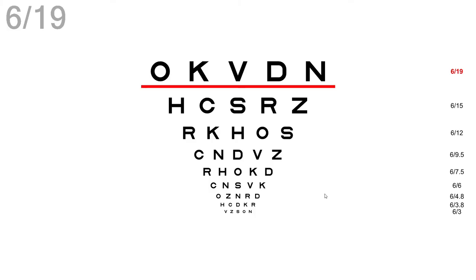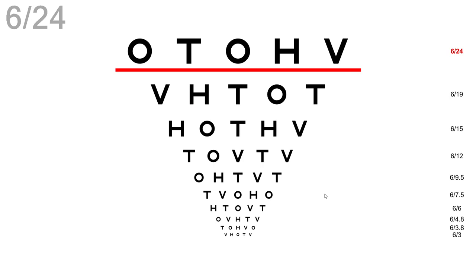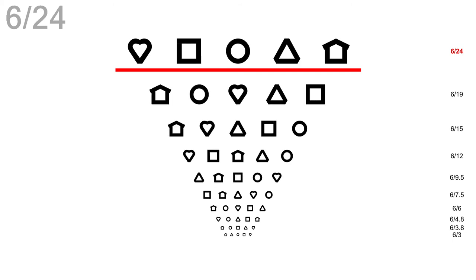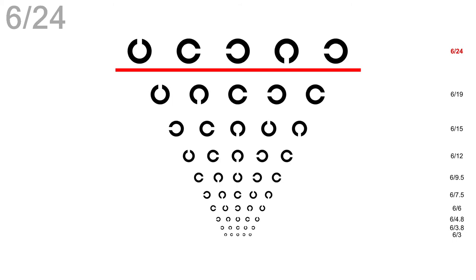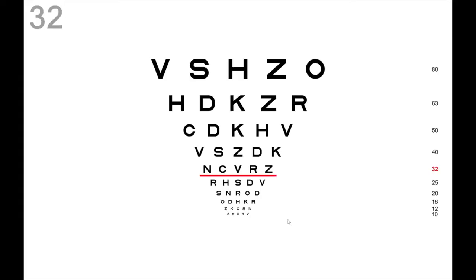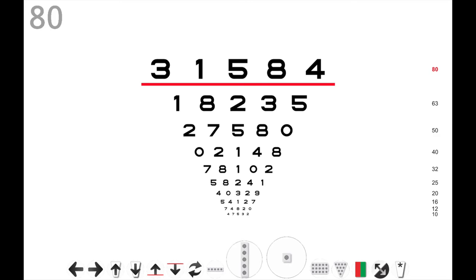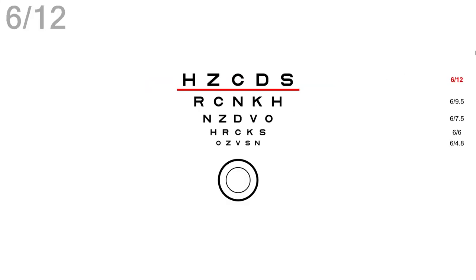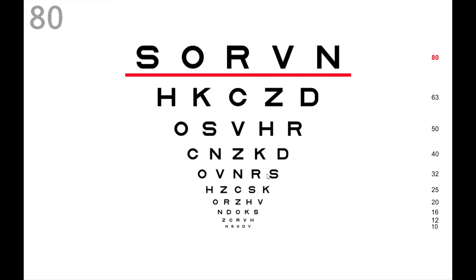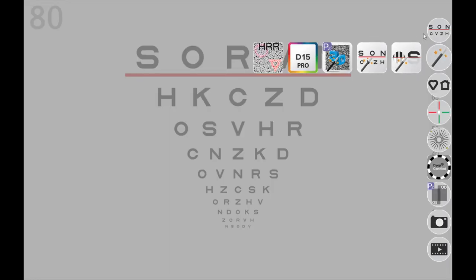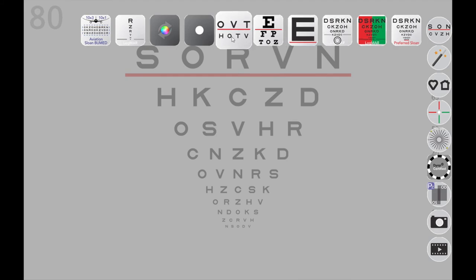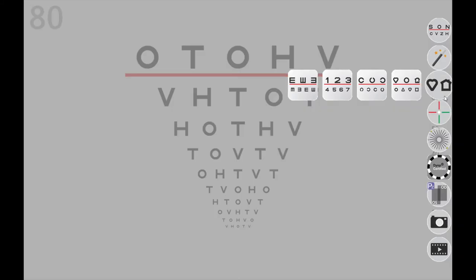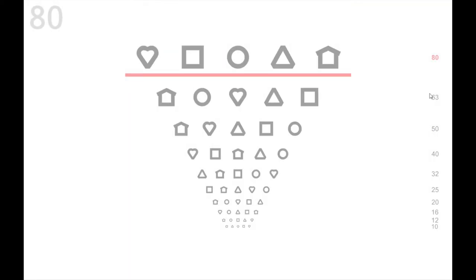Displaying other optotypes with a keyboard: press the T key to display the HOTV. Press the K key to toggle between pediatric symbols, the E chart, and the C chart. Press the 1 key to access numbers. Press the J key to display a combined letter and astigmatic chart. These can also be accessed with the mouse on the right-hand side menu — move the mouse over to the right-hand side dock, select the third icon, and then select which optotype you wish to display. All the optotypes can be masked and randomized.